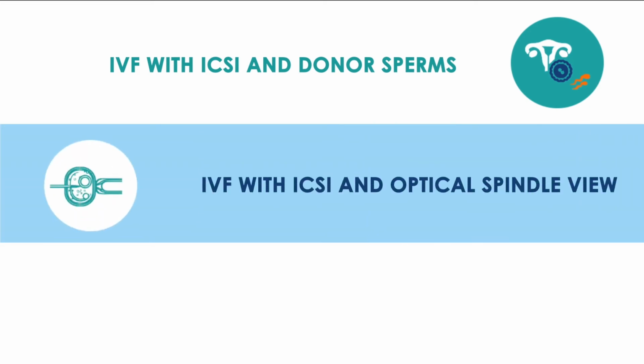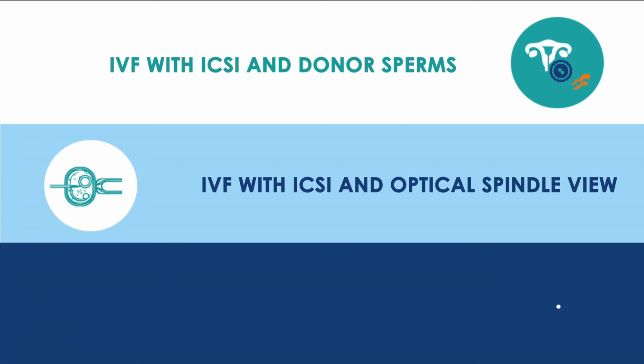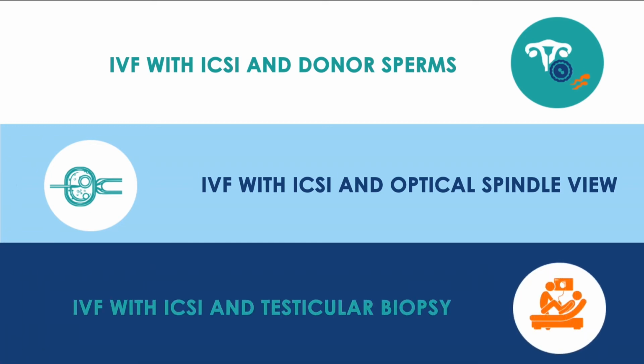This technique helps the fertility specialist view the division of cells carefully to ensure no damage takes place around the site of injection of the sperm. The fertility specialist may order a testicular biopsy to assess the testicular function in the male partner.